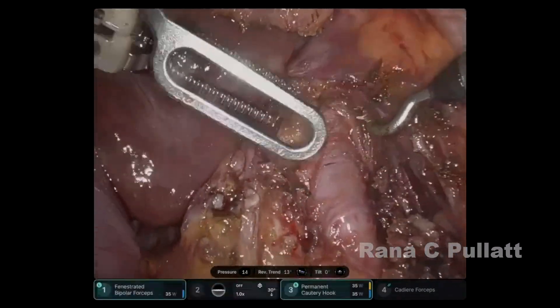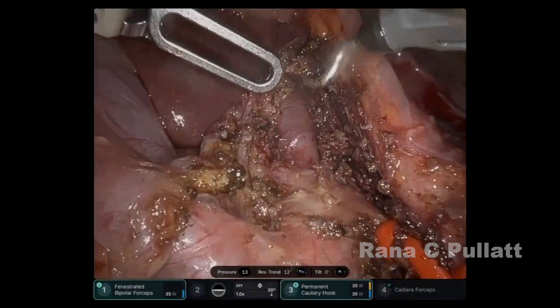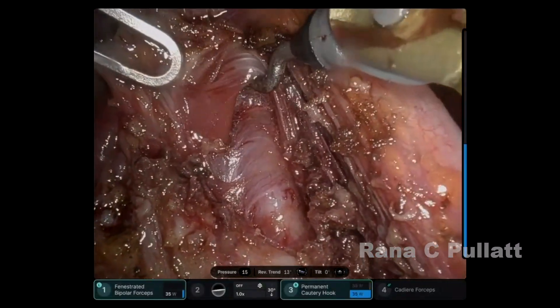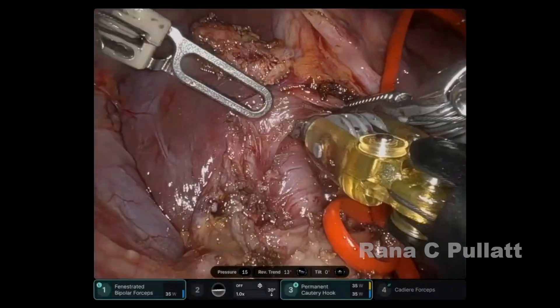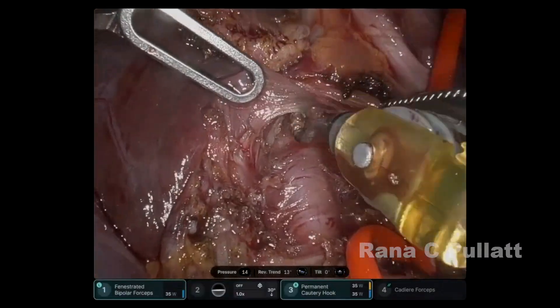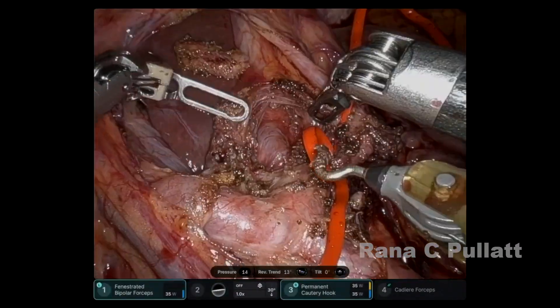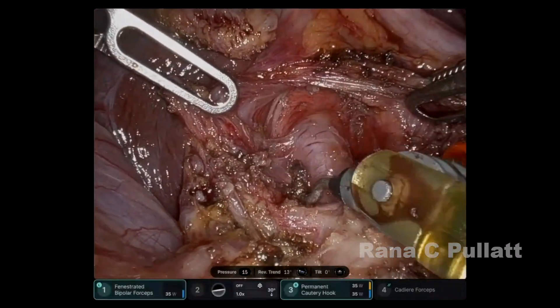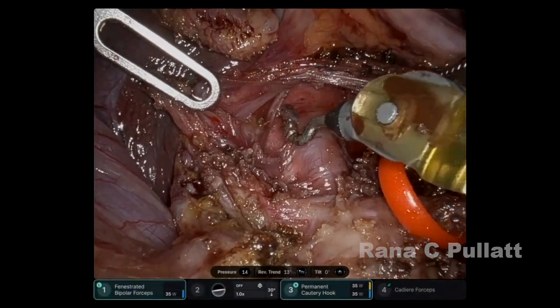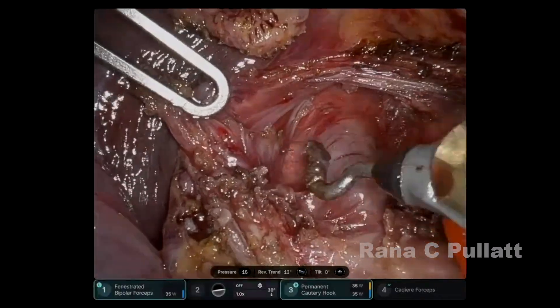The artery is traced all the way to its origin on the aorta and freed up. We can clearly see the artery branching out from the aorta. Once this is clearly visualized and the artery is free, we finish the case. Total console time is 27 minutes.